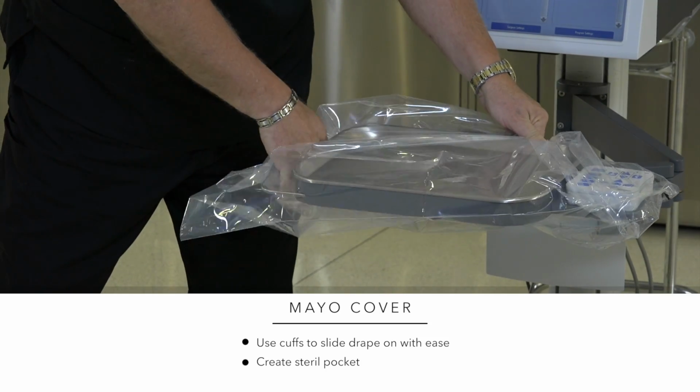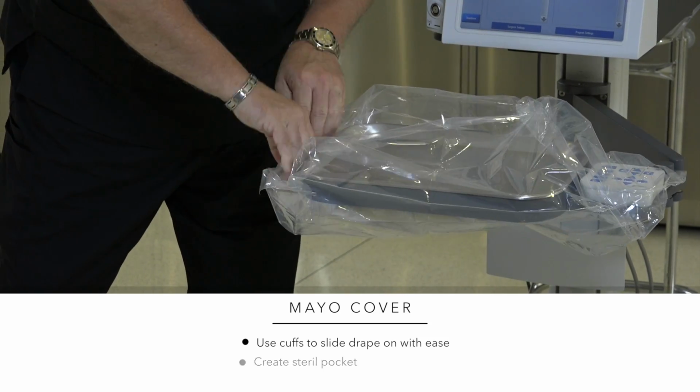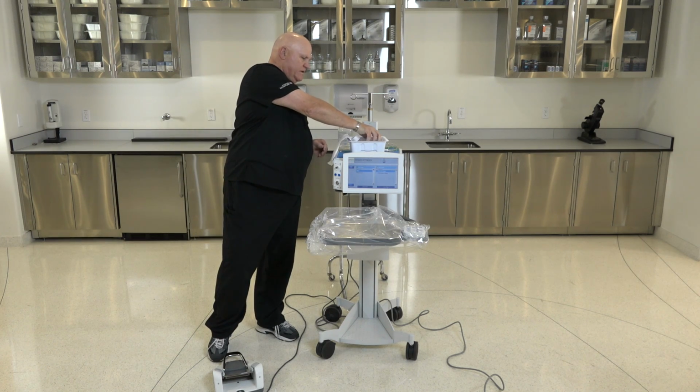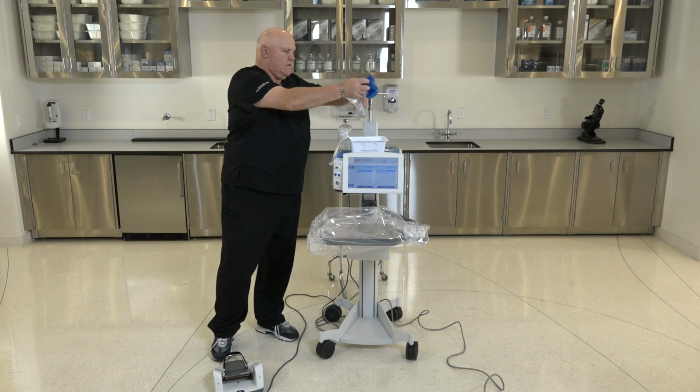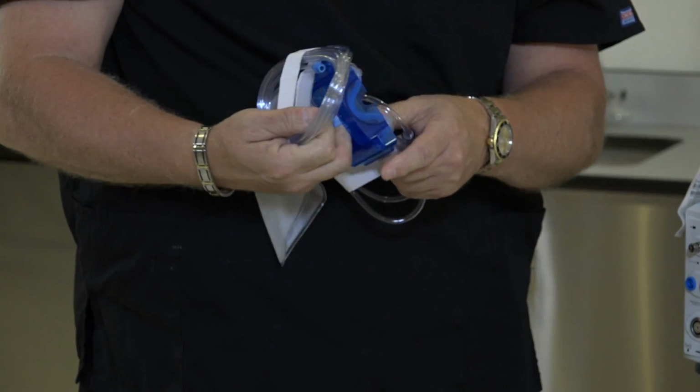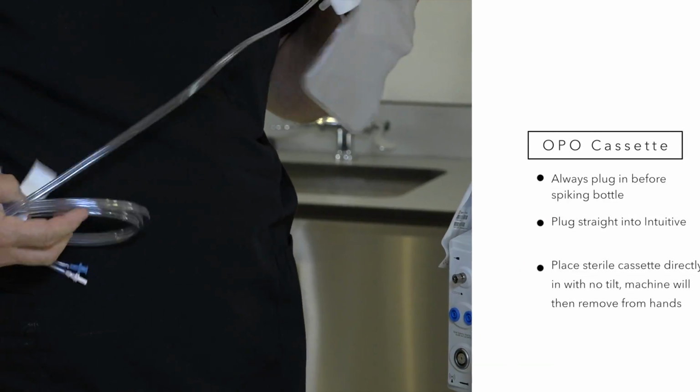And create yourself a sterile pocket for holding your handpiece set. Then you take your tubing cassette and placing the irrigation aspiration tubing onto the sterile field.